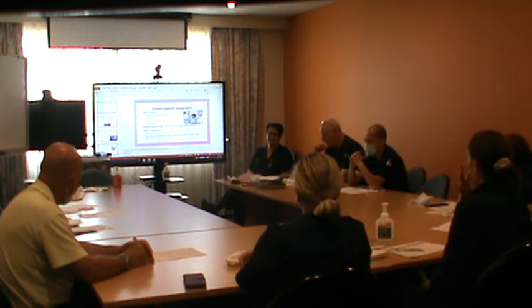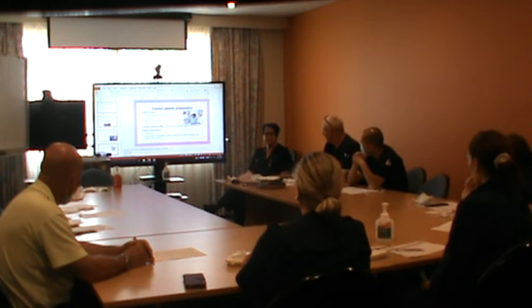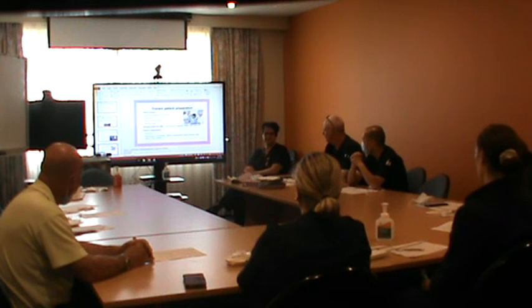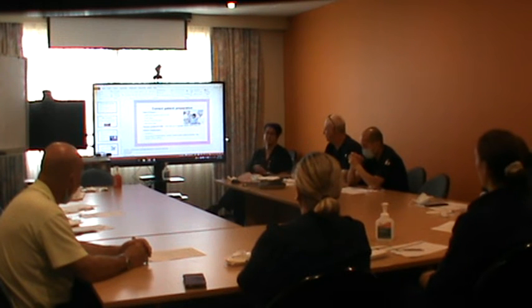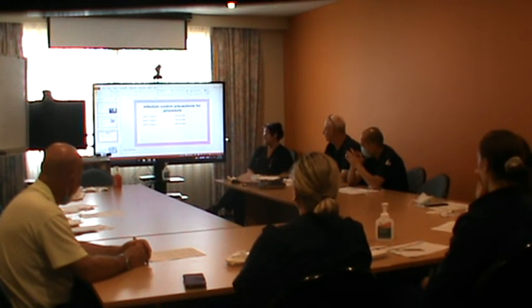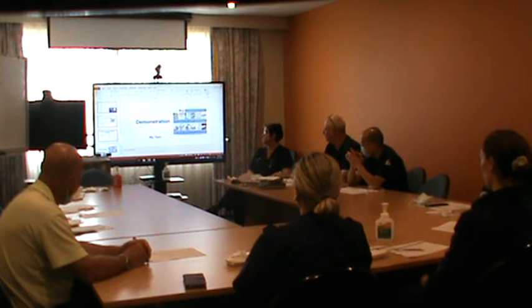Taking into account if someone says to you, look, I passed out the last time I had a needle, please don't do it sitting up. Sit them down first. You've got to look at the structure of the patient. Are they a big patient? What are their veins like? There's so many things to take into consideration before you actually stick that needle or even set up your trolley. You need to look at what you're dealing with as a picture. Position the patient so that they're ready. Hand hygiene is so important, as you know, and the sterile field is so important.